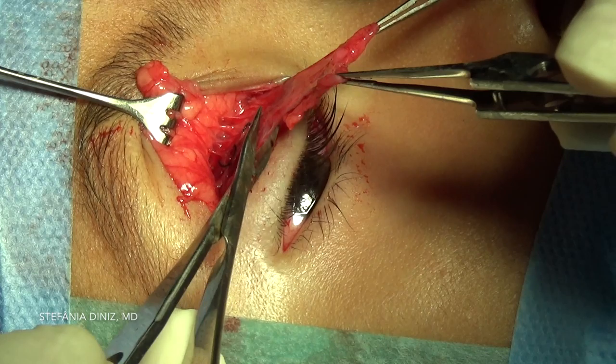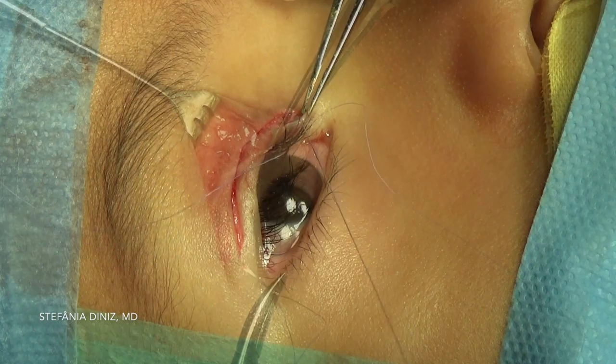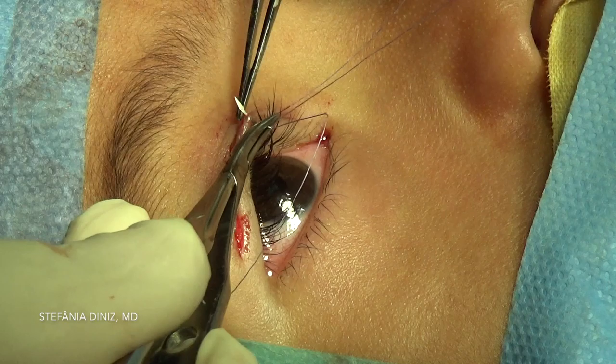The redundant levator aponeurosis is excised with Westcott scissors. Finally, the incision is closed by incorporating the levator aponeurosis into the closure. This is performed in order to recreate the lid crease with a 6-0 Vicryl suture.